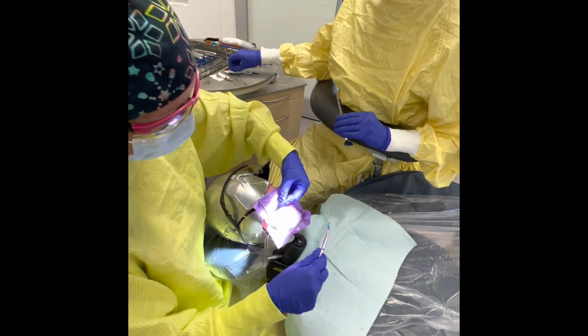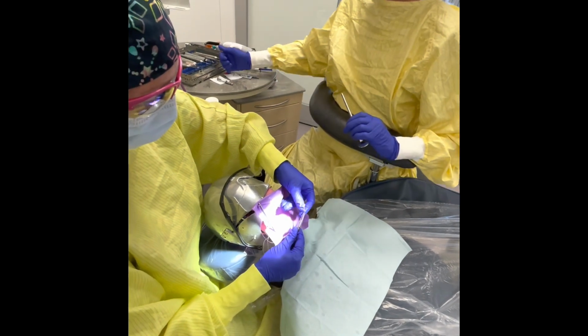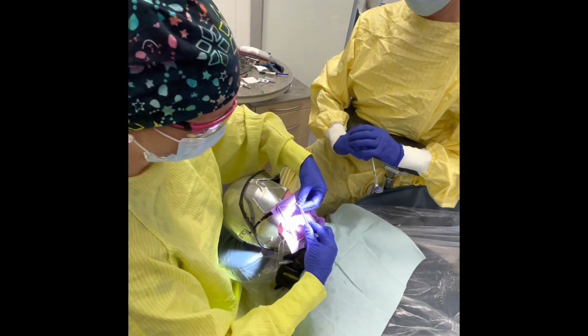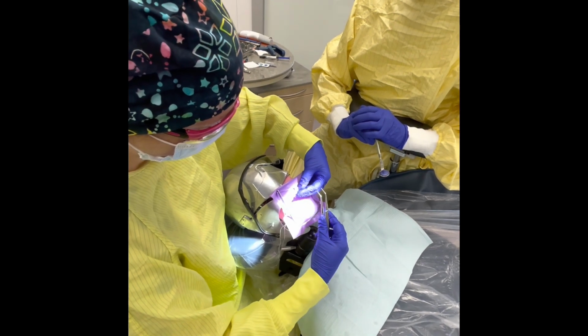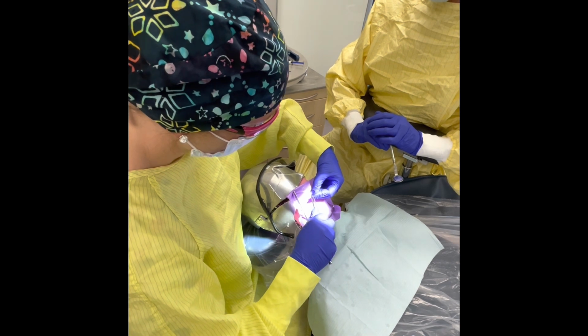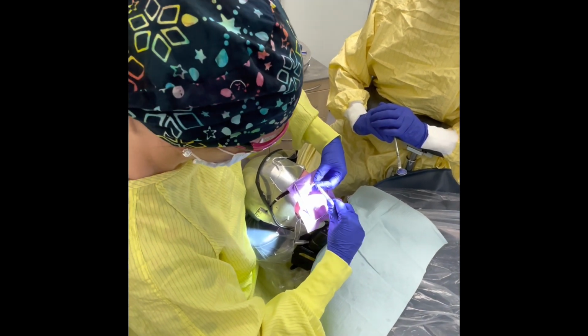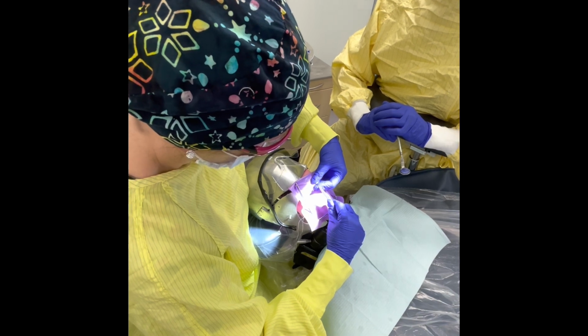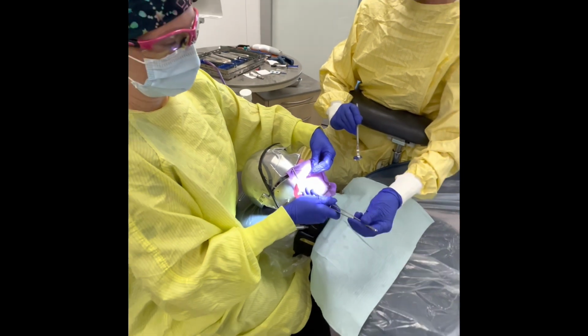Maybe the orange. Yes, please, Stacy. Thank you. Thought I could get the blue guy in there. Sometimes these anterior guys like to fight us. There we go. Okay. I'll take that back.